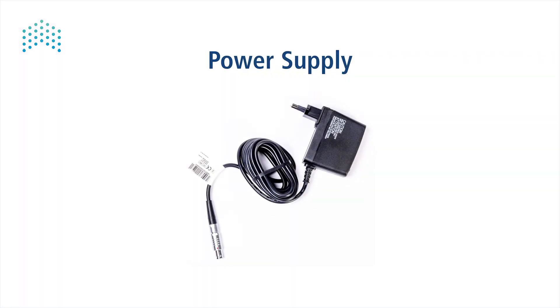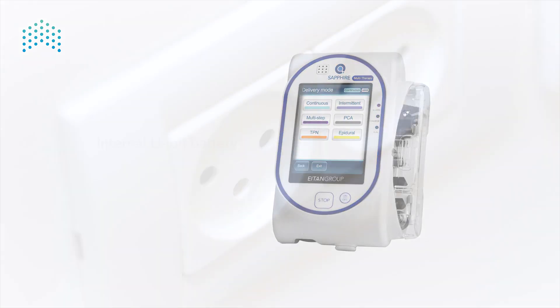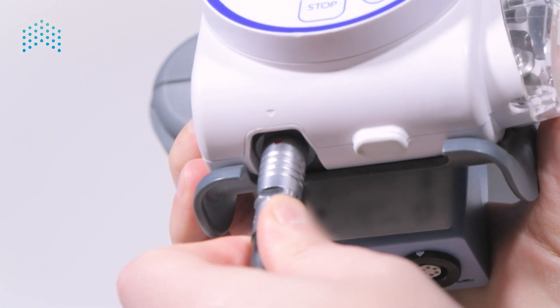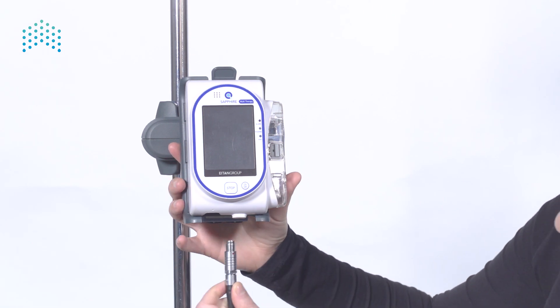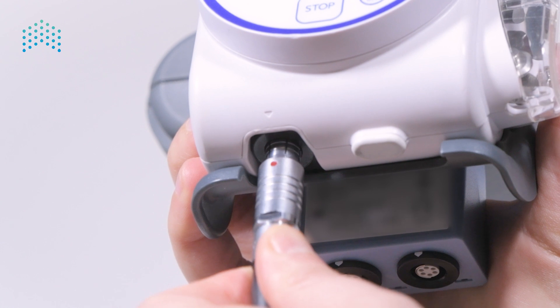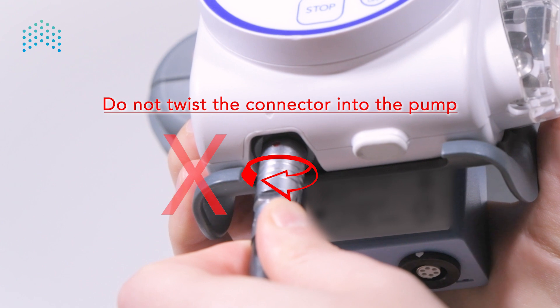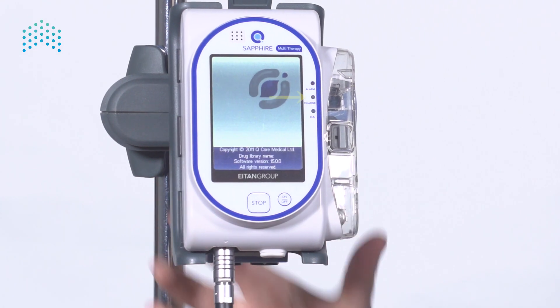Power supply — the sapphire operates on an internal li-ion battery. The battery is charged when the pump is connected to a power source, either directly or via a mini cradle. Simply connect the connector of the power supply by pushing it into the socket at the bottom of the pump and align the red dot with the white arrow etched onto the pump. Do not twist the connector into the pump. Note that the yellow light becomes active.